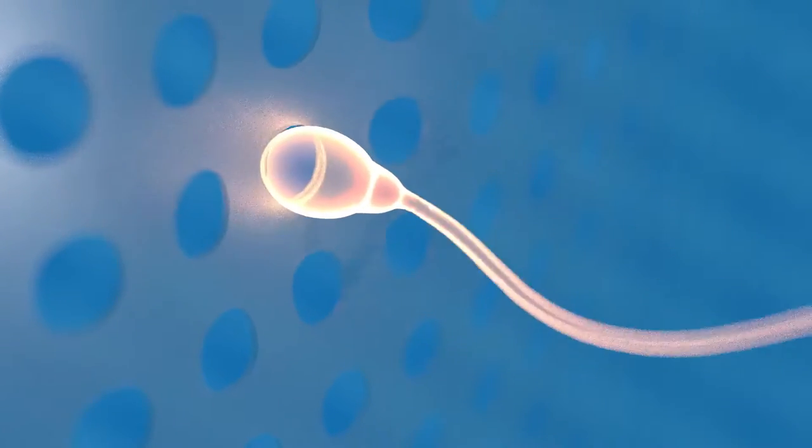In essence, this technique is based on microfiltration. Sperm migrate along microchannels or through the pores of microporous membranes, separating and selecting high-quality sperm with high motility and normal morphology. Subsequent to sorting, sperm are used to fertilize eggs.